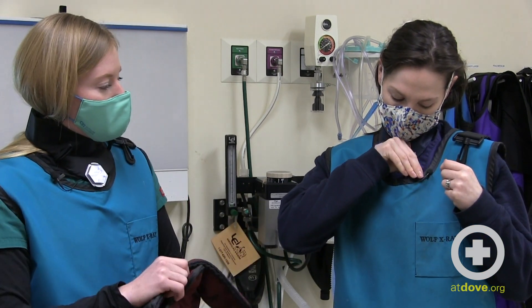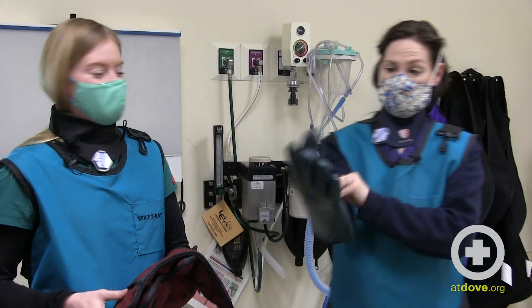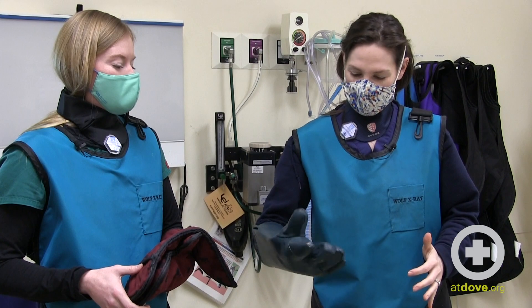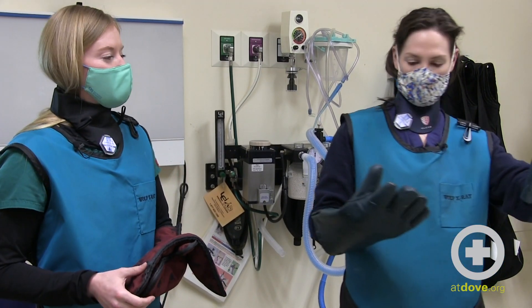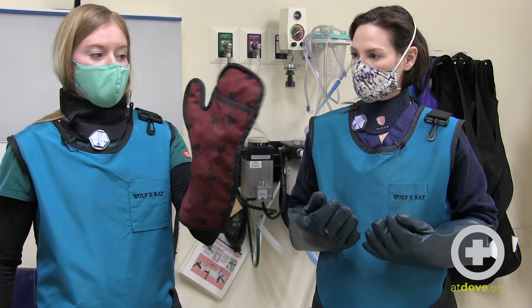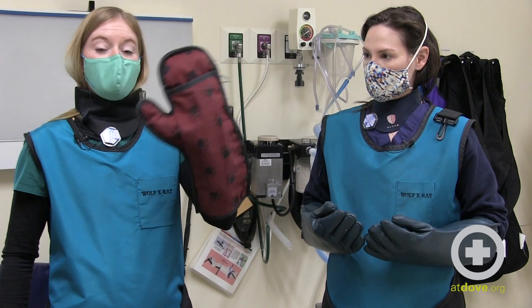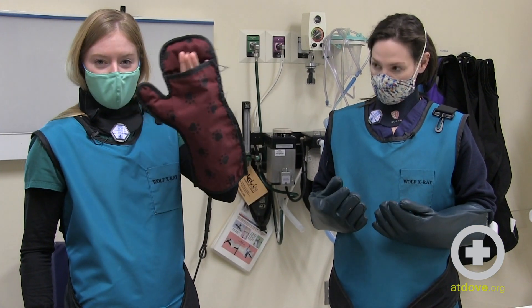Jess has another variety of gloves here — one that has fingers in it. This is personal preference, whether you like the finger gloves or the mitten gloves. I personally like the mitten gloves better. Remember that when you're actually taking the radiograph, your fingers need to be completely concealed inside that lead-lined glove. No cancer fingers.